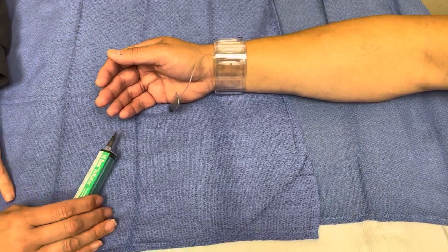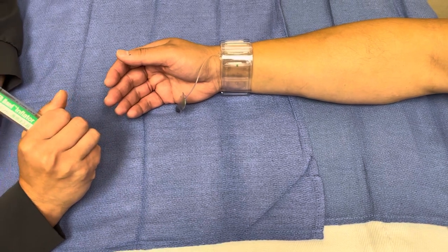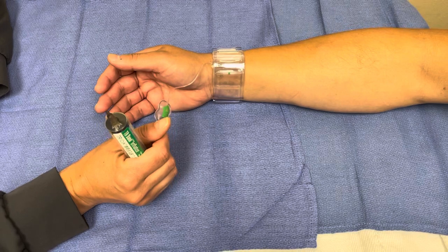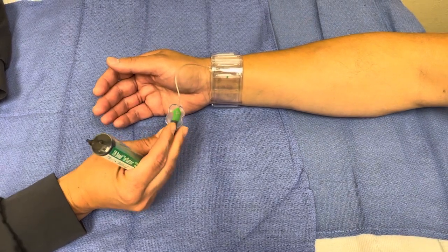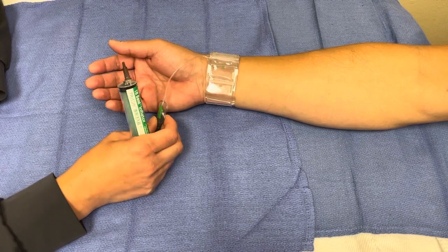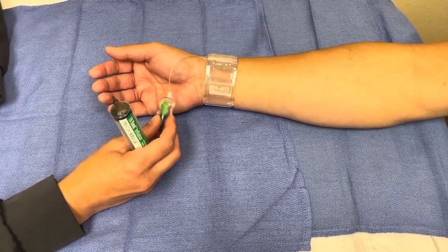First of all, we're going to give you in report how many cc's or mils of air were left in the band. So make sure that you got that. If you did not get that, make sure you ask that question. Also, we're going to tell you if it was a diagnostic procedure or an intervention procedure, because those are different.